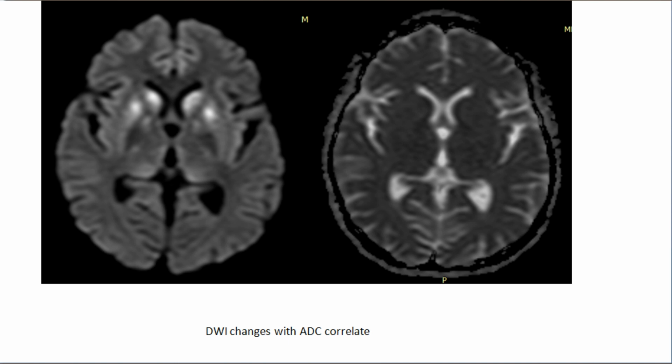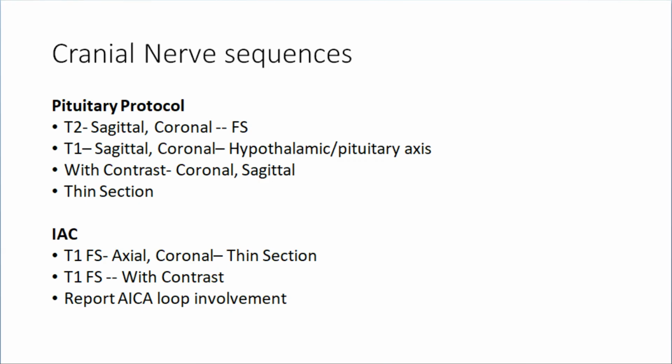As soon as I saw this, I think about some kind of metabolic disorder. First thing first, some kind of hypoxic insult or metabolic disorder. There's a differential, okay, if you see the imaging evidence of deep gray involvement. And this patient clinically, and then on imaging we proved it, we are even writing a case report because this case was different, not based on the imaging, but otherwise, Wernicke's encephalopathy. We saved the life of this lady. She was in ICU for almost 5 days, undiagnosed.